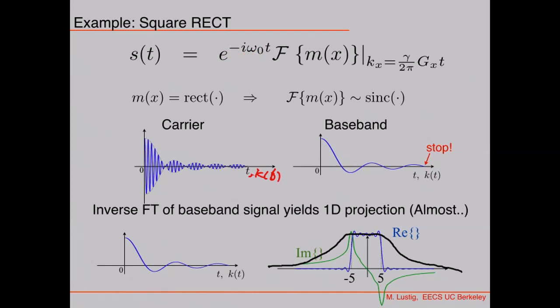And then the baseband signal is sampled using an analog to digital converter. So the demodulation is done by the machine. Yes, the demodulation is done by the scanner, because the scanner knows what the resonance frequency is, so you can just demodulate by that. And it's going to be 127 megahertz, 127.69 or something like this megahertz at 3T.